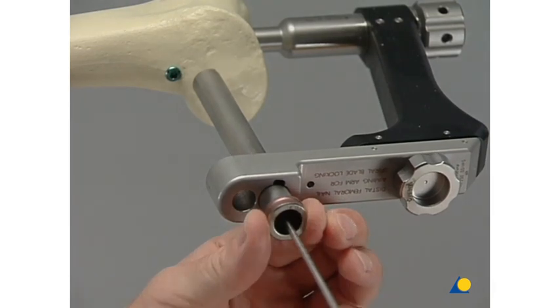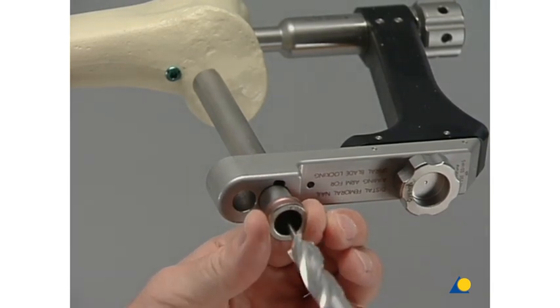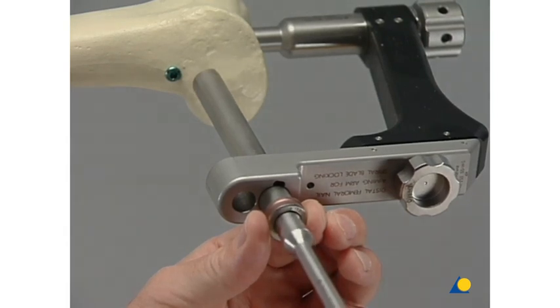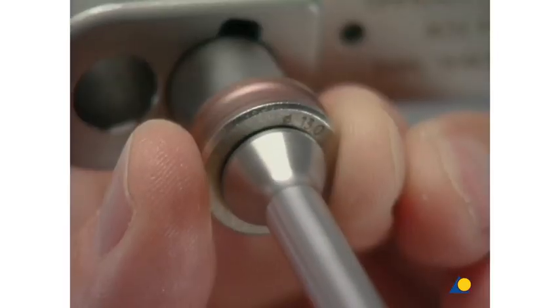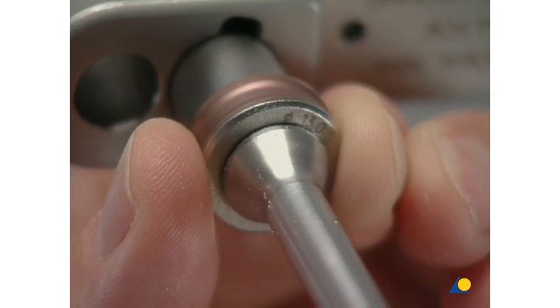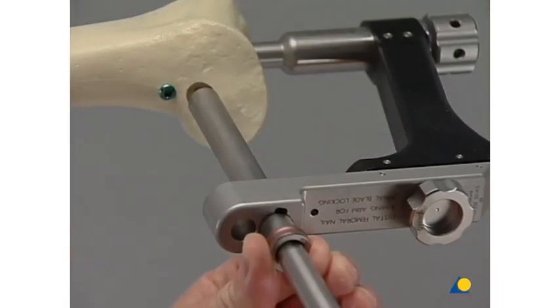The 13 mm drill bit is inserted over the guide wire and through the protection sleeve. The seat for the head of the spiral blade is prepared by drilling open the lateral cortex. The automatic stop prevents the drill bit from penetrating too far. The drill bit and the protection sleeve are removed.